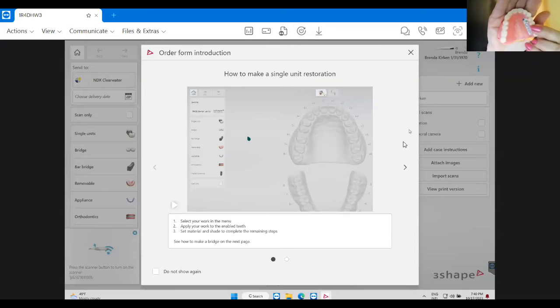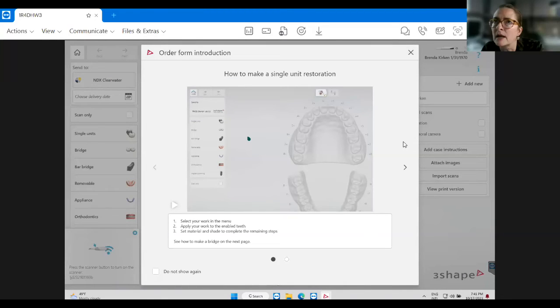And I just do like a snake. I usually start right by the palate, the premolars, and then come down all the way. That way it captures the scan. The scan captures it really well because scanners look for lumps and bumps and landmarks. So you applied the flowable.